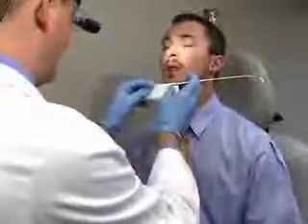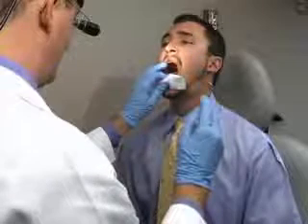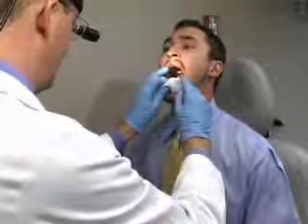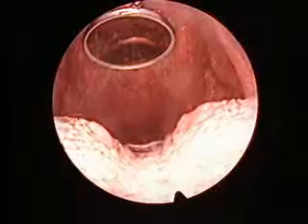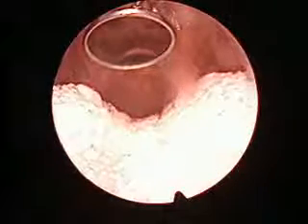Next, gently grab the patient's anterior tongue with a sterile 4x4 cotton gauze pad. Ask the patient to take slow, deep breaths through the mouth. Pass the mirror into the patient's oropharynx without touching any mucosa, then slightly angle the mirror downwards. Visualize the mucosal surfaces of the oropharynx, larynx, and hypopharynx. Ask the patient to say E and observe the dynamic motion of the true vocal cords.